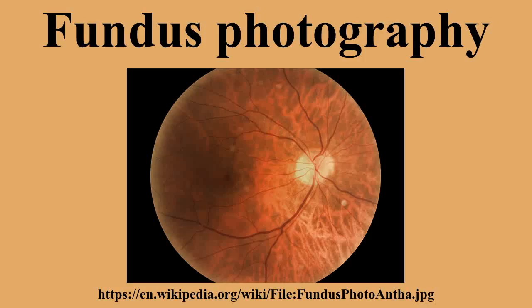Indications: optometrists, ophthalmologists, orthoptists and other trained medical professionals use fundus photography for monitoring the progression of certain eye diseases.